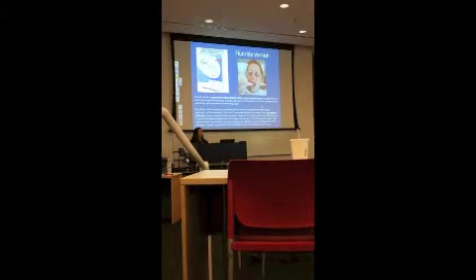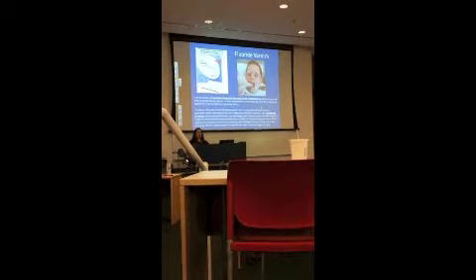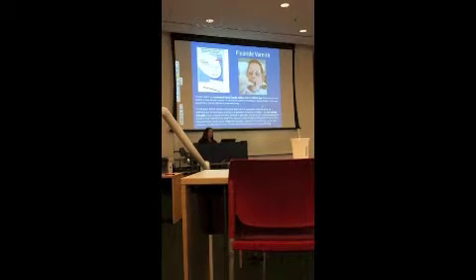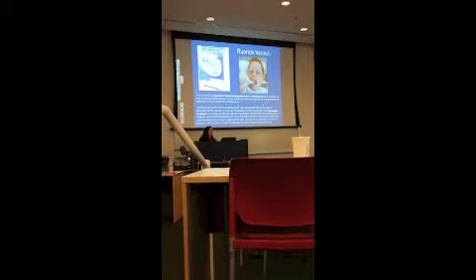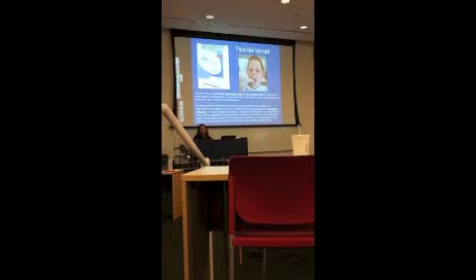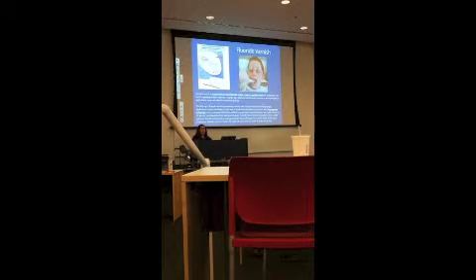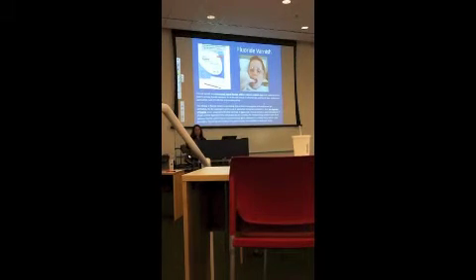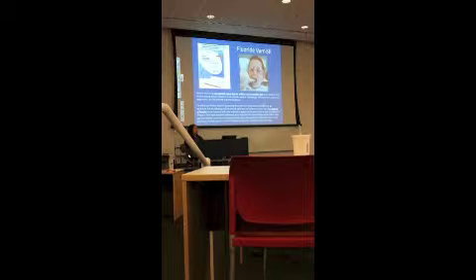You're going to go ahead and seat your patient in an upright position just to explain the procedure to them. If the patient is younger than 18 years of age, I believe, you have to get a consent from the parent. So usually in dental offices, in our office, we just apply varnish to 16-year-old patients or younger, okay? So you will inform the patient of the treatment, get the consent, and then you're going to go ahead and review the patient's health history as well. So that's the first thing. You're going to wash your hands and then get started with the treatment.